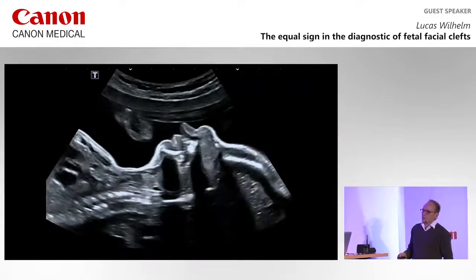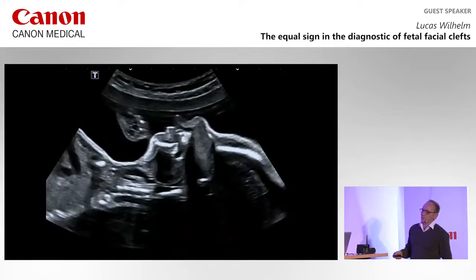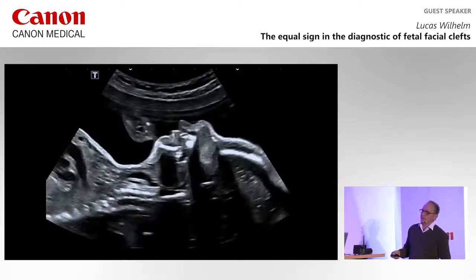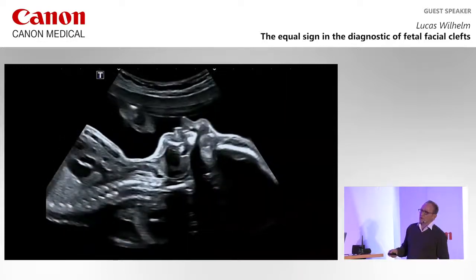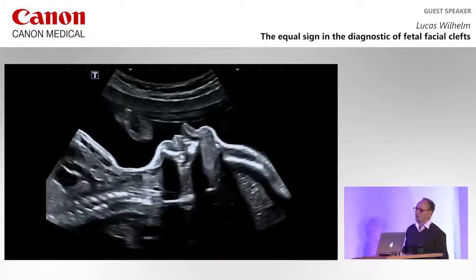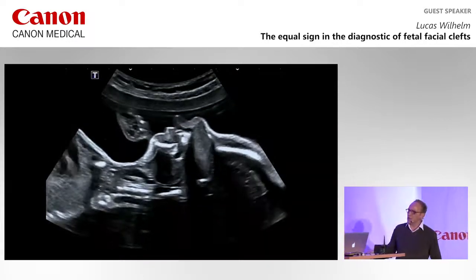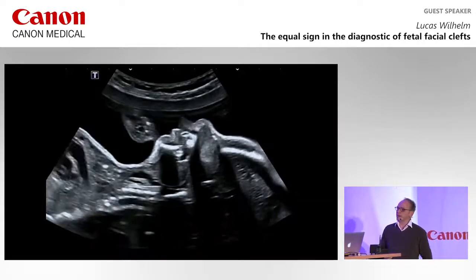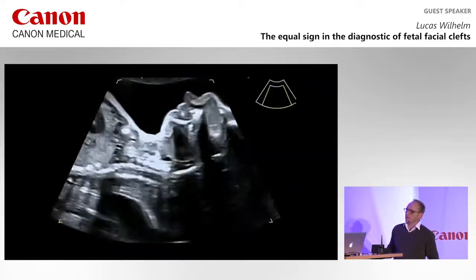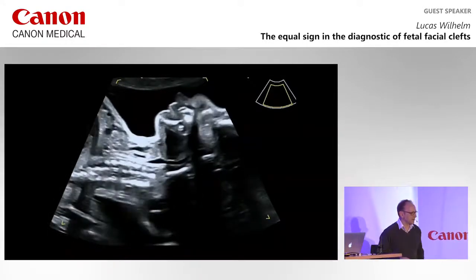So it's more difficult to differentiate because the pharyngeal space is very narrow, and the tongue is lying very deep here. You see, there's no space between the posterior wall of the pharynx and the tongue. But you can see it. If you are trained, you can see that there is no soft palate behind the tongue. When the child is drinking and moving the tongue, look here. Okay? You can clearly see it.